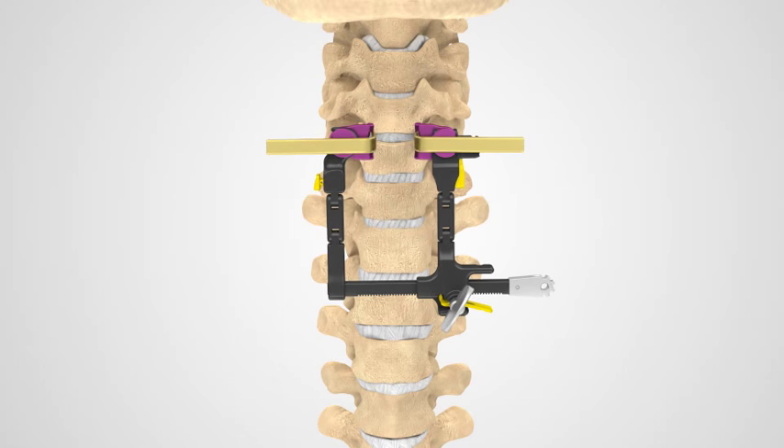Your surgeon will make a small incision over the treatment area towards either the left or right side of the front of your neck. A retractor will be used to provide your surgeon direct access to the affected area.